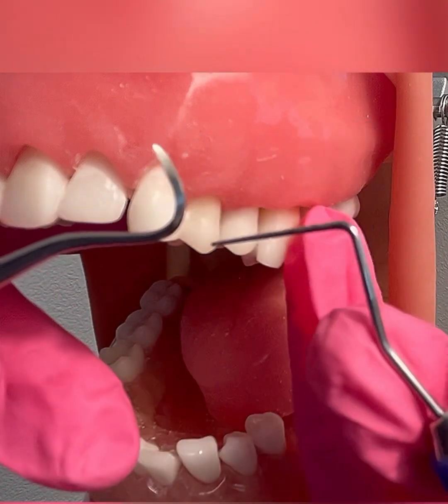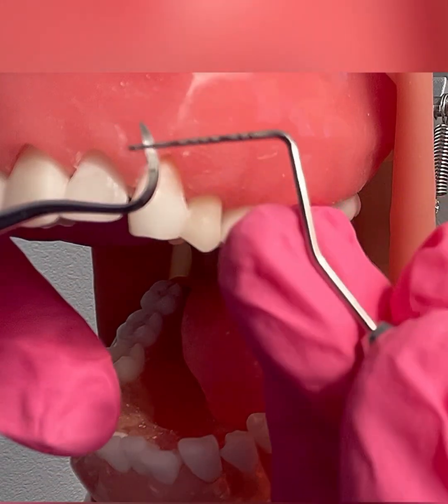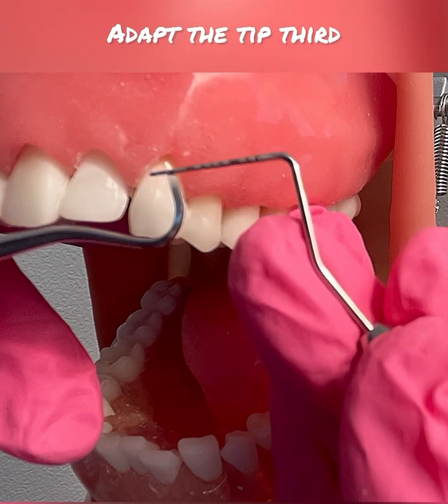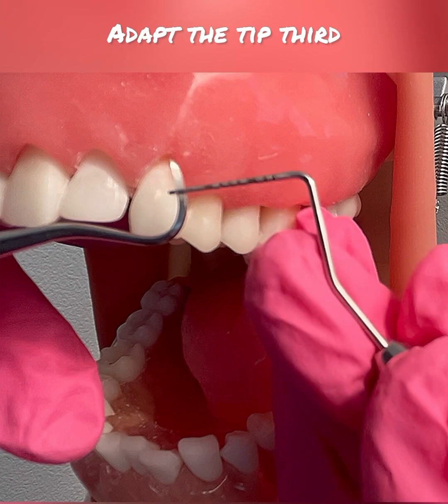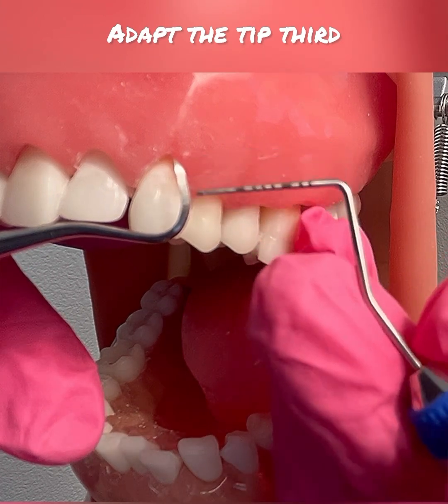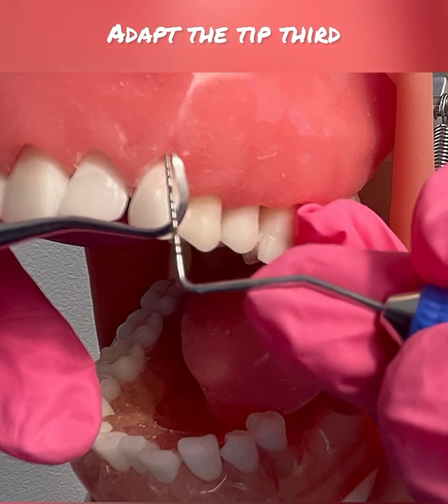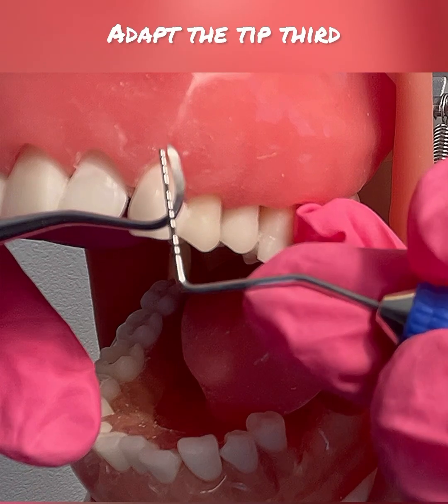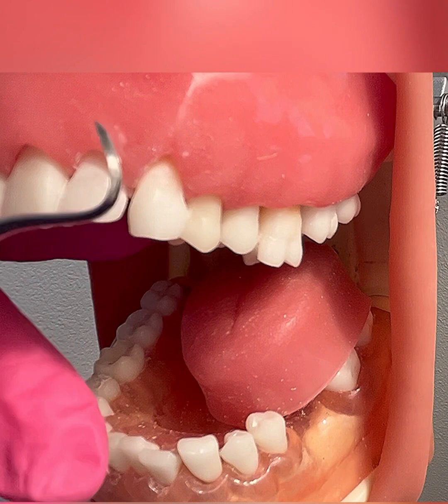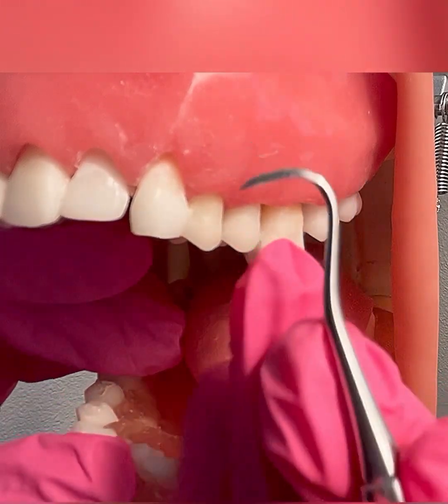I am going to show you three sections of the instrument. The first section is the tip third, then we have the middle third, and then the back third. If you have your UNC probe, you can measure exactly how many millimeters the tip third is — it is about one to two millimeters. So when I say adapt the tip third, you're really only adapting two millimeters of that working end.